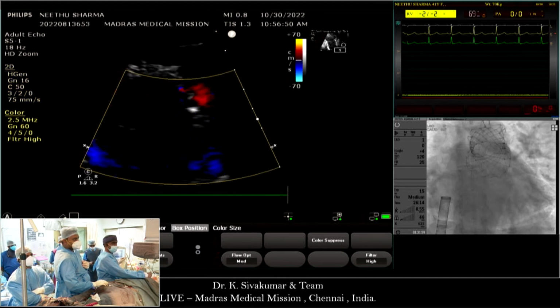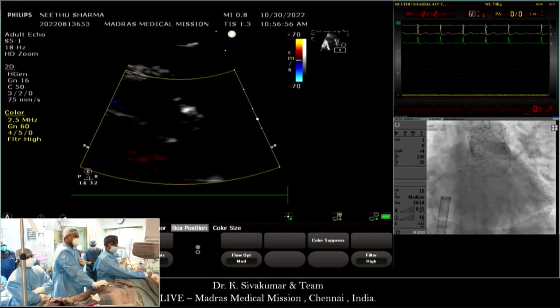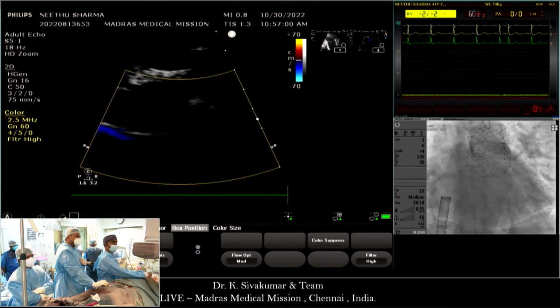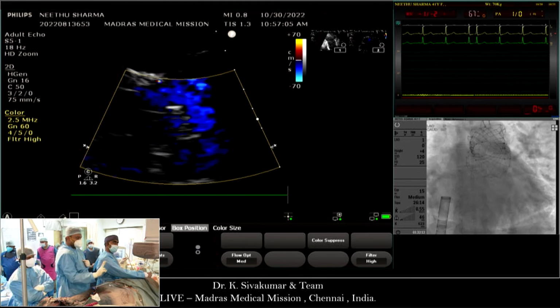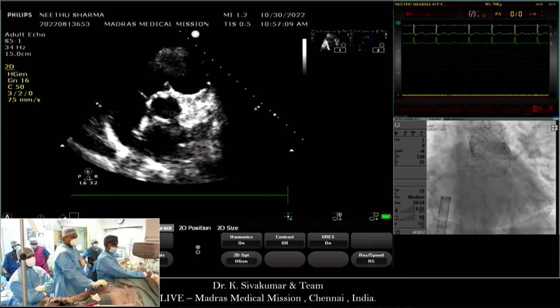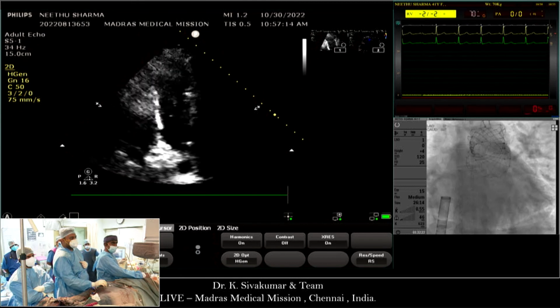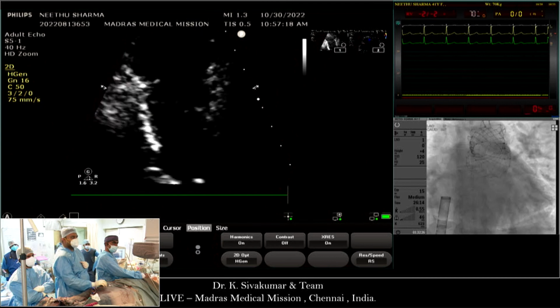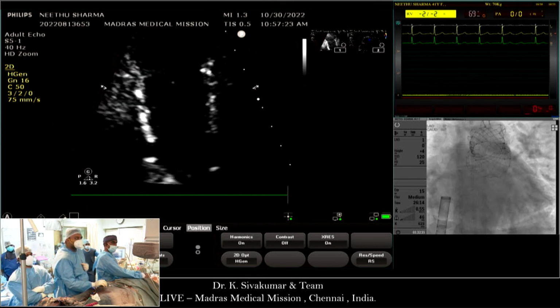Shak, let me share with you our experience on venous pulmonary valve thrombosis. We have 2 patients with thrombosis. Shak, can you hear me? Yes, I can hear you very well. We admitted the patient, gave heparin and then dual antiplatelet, and so far the patient is doing well. The gradient dropped without any further management.